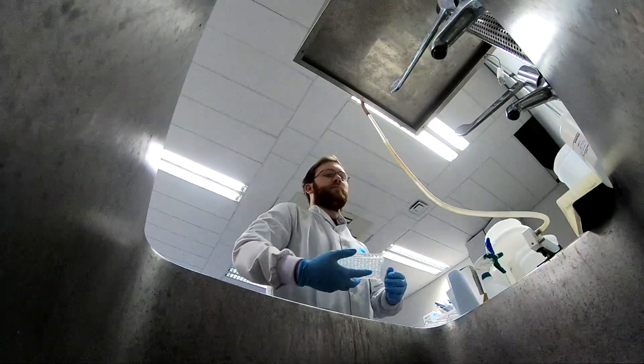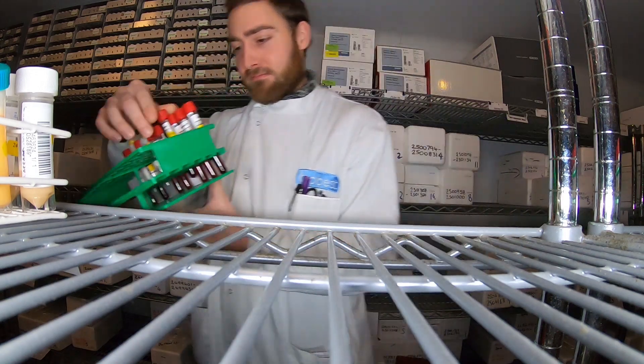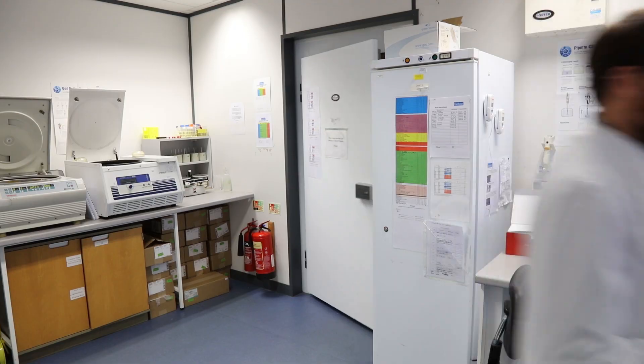If we take BVD ELISA, for instance, for our in-house test, once we've harvested the antigen, we would then coat the plates and leave them overnight. On the day of the test, we take the samples out, we add the serum to a dilution buffer, and we then put that in the incubator for an hour. If the antibody is present, they will then bind to the antigen.